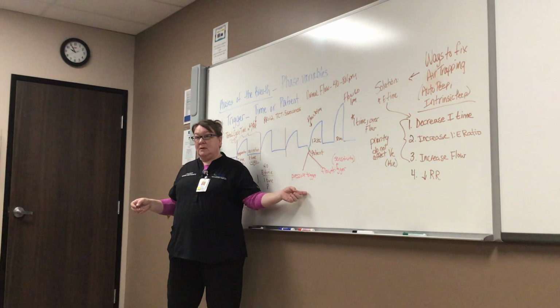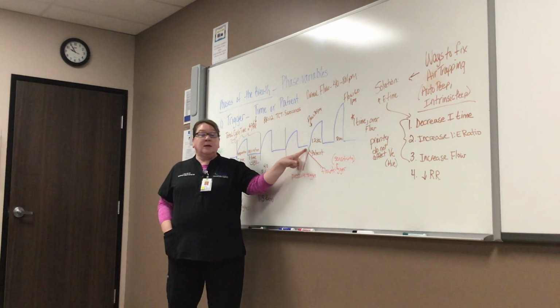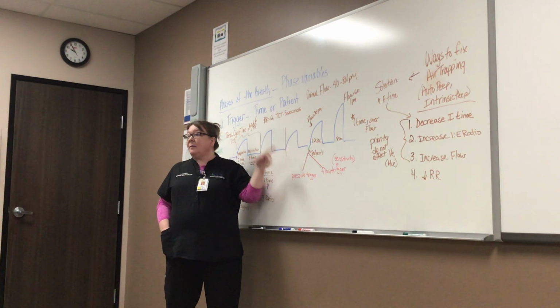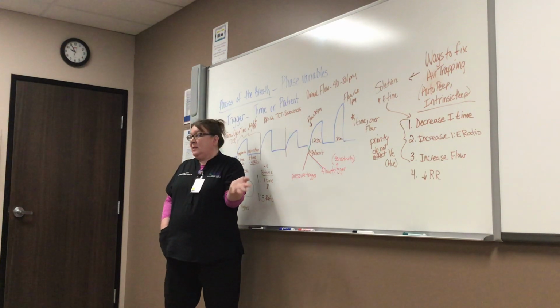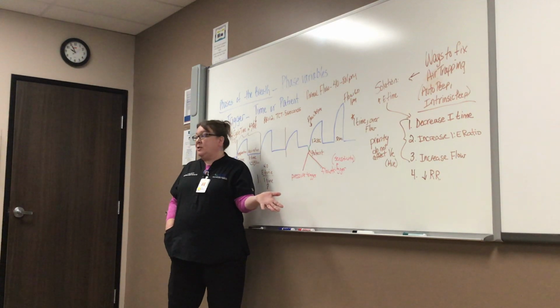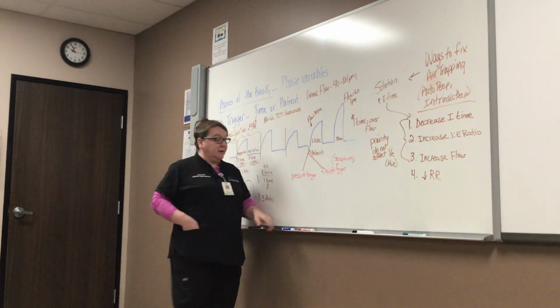So setting the sensitivity or the trigger, the patient trigger or the flow trigger properly is also very important. This is only going to be affecting patient breaths that they're initiating. It doesn't affect time. Time is going to be given when it's time, no matter what, just like clockwork. But now if my patient wants a breath, how is the ventilator going to know? That's what we're telling you here. What will the ventilator sense so that it knows the patient's trying to take a breath, so it'll kick in and give one. So pressure sensitivity is not the best, but the concept is fairly easy to understand.